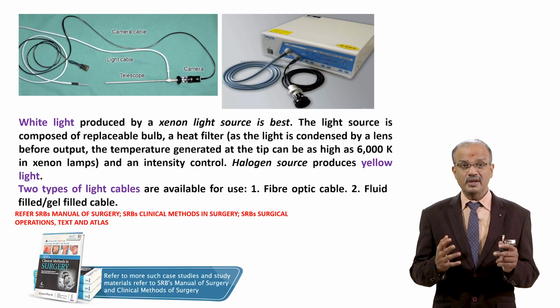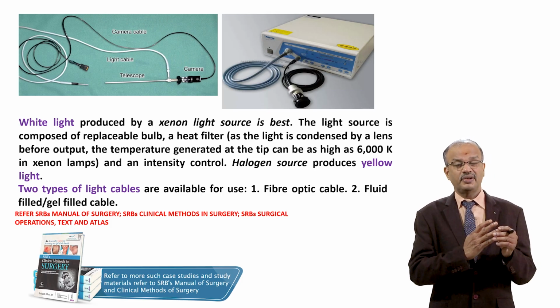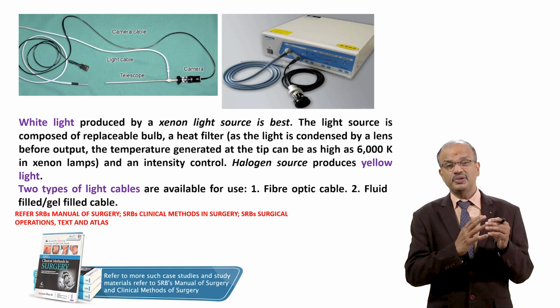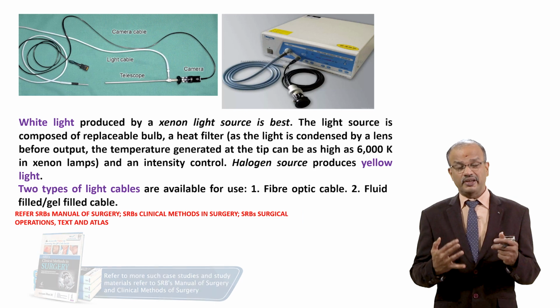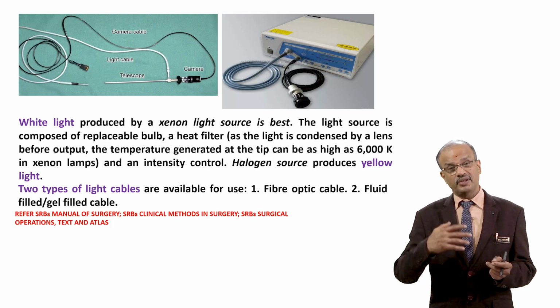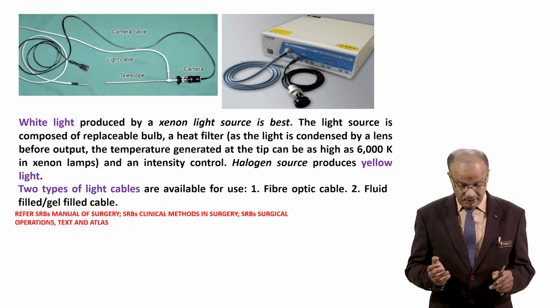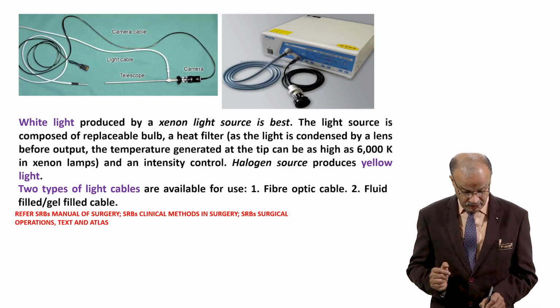It gets spoiled easily. So instrument care is important: the high definition camera, xenon light source, and fiber optic cable, we should handle them very carefully. As a laparoscopic surgeon, it is our responsibility to handle them carefully and guide the sisters and technical staff. Otherwise, durability will be lost, because a lot of money is involved. So taking care of these instruments, for the benefit of the patient and our own system, is very important.